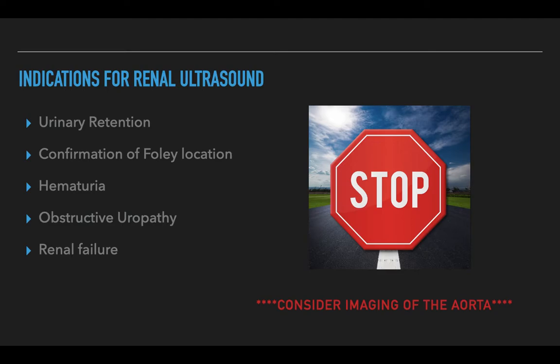It's important to know that ultrasound also has its limits, but if you have a patient who is specifically coming in older, has symptoms of maybe renal colic, the other structure that you should definitely consider imaging is the aorta. So make sure if you're considering renal pathology in a patient who is older and has maybe some atherosclerosis or fits the picture for having potential aortic pathology, you also take a look at the aorta. It's very quick and easy.